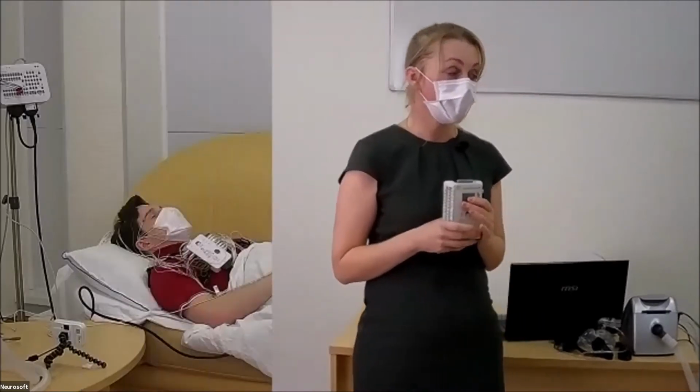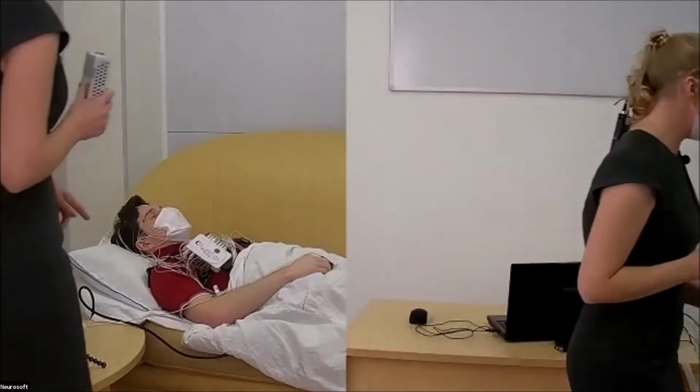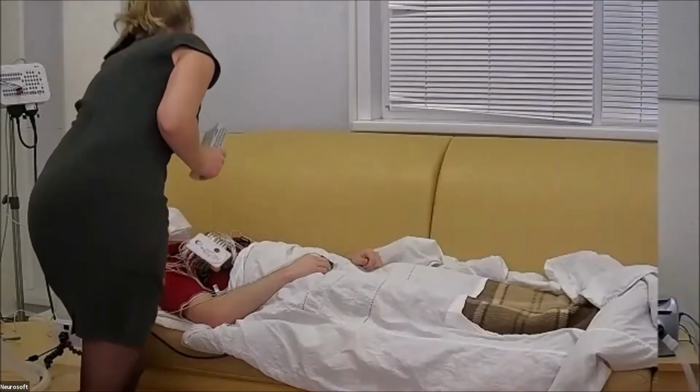The great advantage of this system is that it is portable. It means that all electrodes and sensors we connect to the unit, to the device, and put on the patient with a special belt. And our patient, of course, is free to move. Now in our case, we have a patient unit connected with a cable to the system.